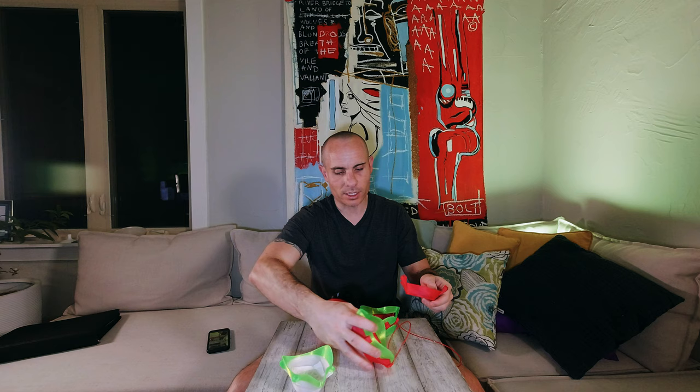Now, the problem I had with this mask is that it prints out in two separate pieces. So you have this TPU layer and you have this PETG layer and you have to figure out a way to bond them together. I used super glue and it still just kind of came apart. So I took this design and I used Fusion 360 from Autodesk to merge the two meshes together, the mesh from this and the mesh from this, and what I came up with was this mask.